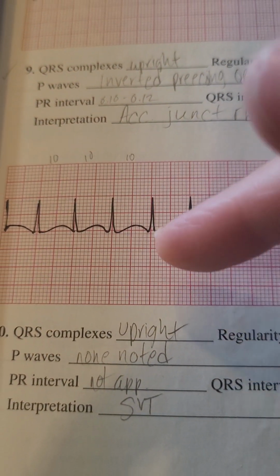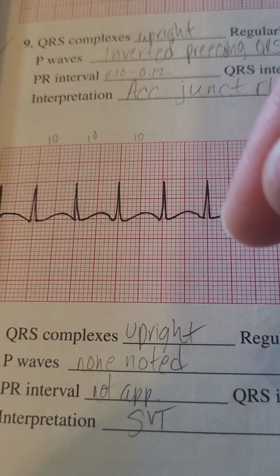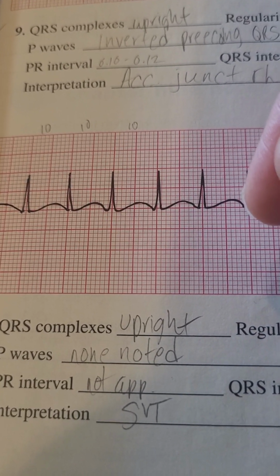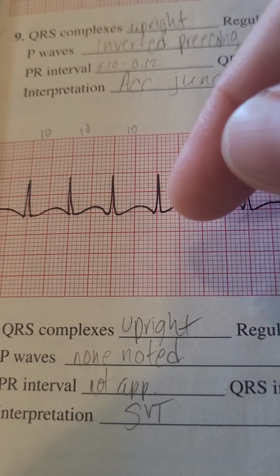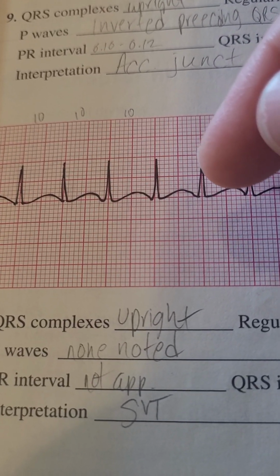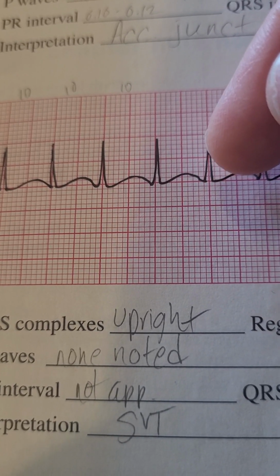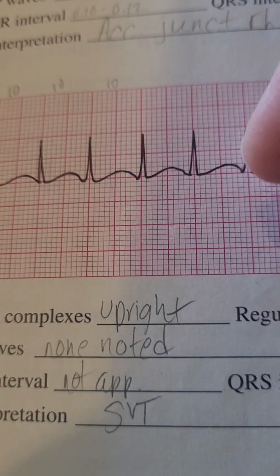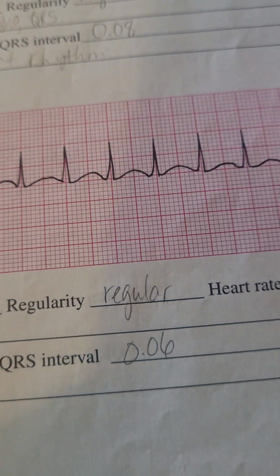Sometimes with these, I want to say SVT, but it's either junctional tachycardia or SVT. I think for junctional, if you want to call it junctional tachycardia, you still have to see some type of P wave in there to call it that. So for this one, just call it an SVT because it's running pretty fast too.